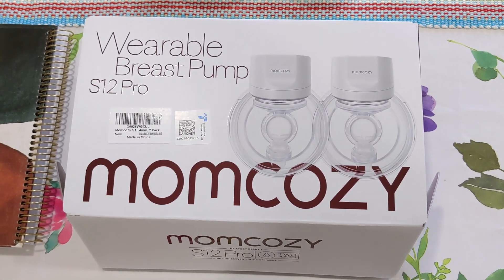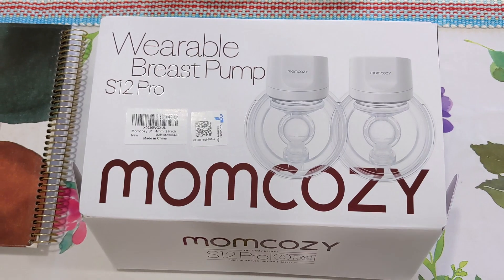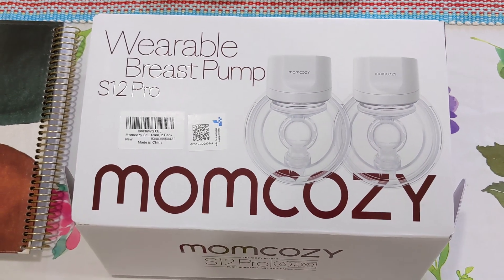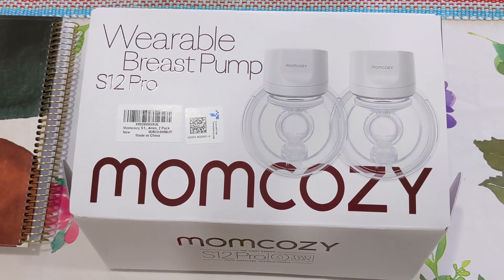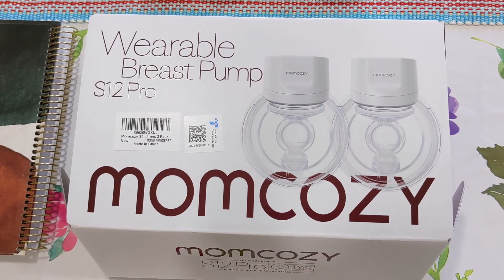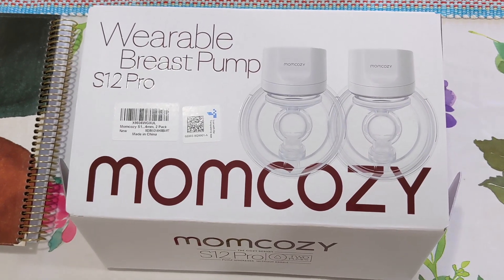Originally the plan was to use the wearable pump and the traditional pump together, because most people say wearable pumps don't empty your breast as well as traditional pumps like the Spectra S2 Plus. But my experience is that these wearable breast pumps actually work really well.